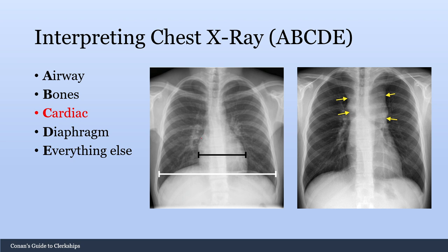C is for cardiac. One of the main assessments here is the cardiothoracic ratio for cardiomegaly, which is defined as a cardiothoracic ratio greater than 50%. You can also check for mediastinal widening, which is concerning for something such as aortic dissection. Notable anatomical landmarks include the aortic knob, which represents the aortic arch, and the right atrium border.